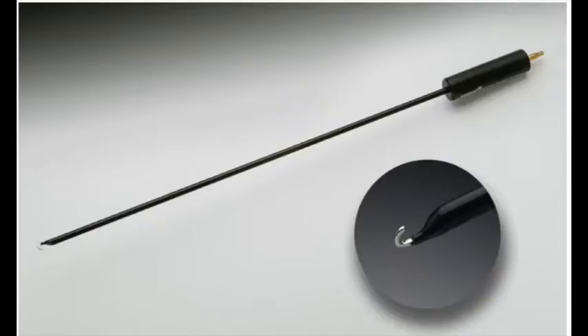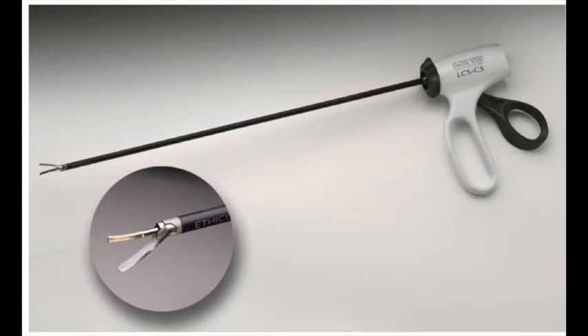We also have a J hook that can do the same thing — the angle is just different; instead of an L, you're looking at a J. We also have an endo harmonic scalpel — there's a regular harmonic scalpel as well, but this one is for endoscopic surgeries. You'll find it on the surgeon's preference card. We don't necessarily open it because it's expensive, but we'll have it available for the surgeon.